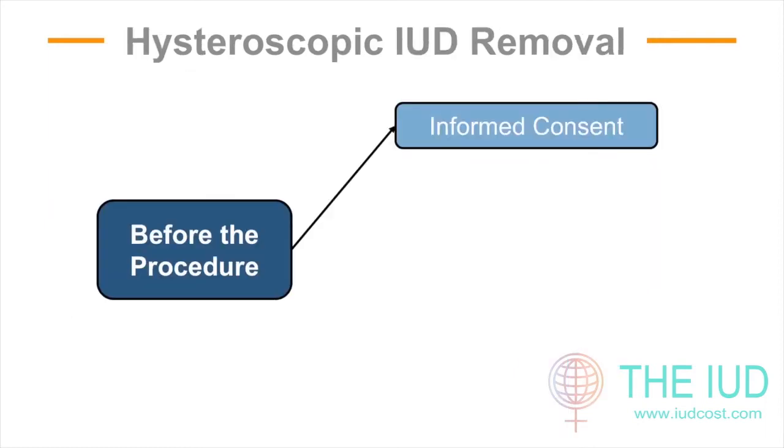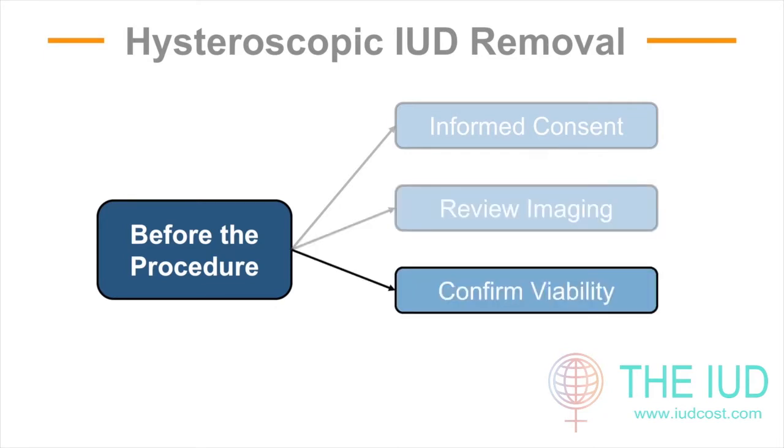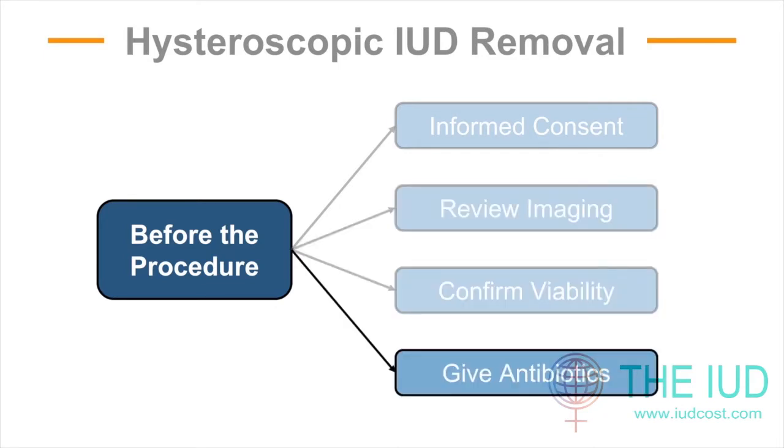First, ensure pregnancy continuation is desired and obtain informed consent. Complications are uncommon, but risks of gestational sac rupture and miscarriage are discussed with all patients. Review preoperative imaging to plan your surgical approach, and before the procedure, we confirm viability and administer a single dose of cefazolin.